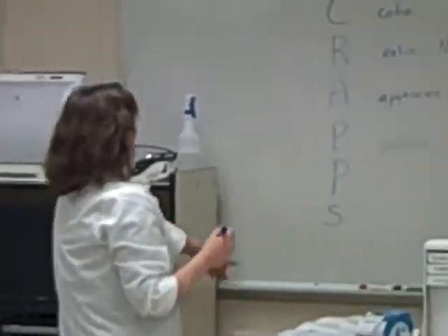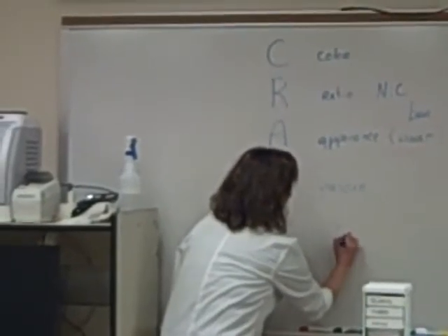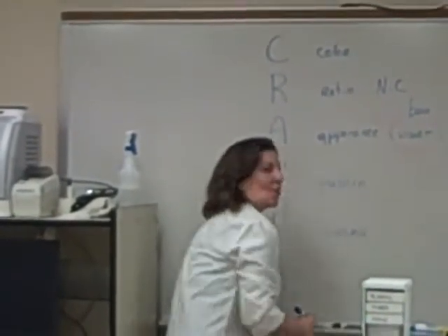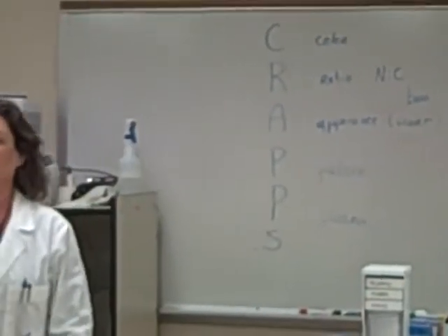All of these things we can use. The second P is plasma, or cytoplasm. What's in the cytoplasm? Does it have granules? Is it clear? We want to look at the cytoplasm and see what's in there.